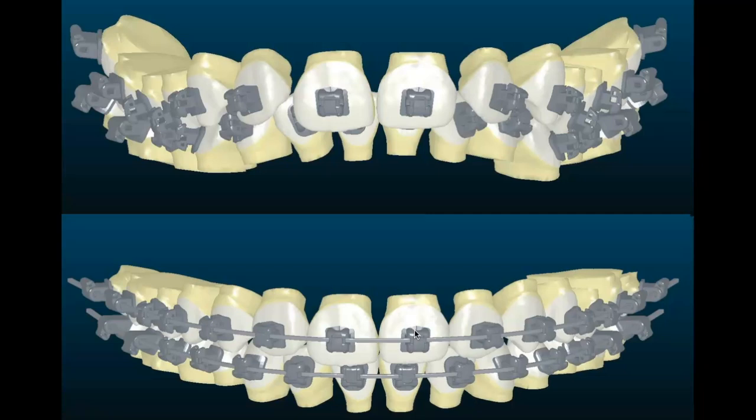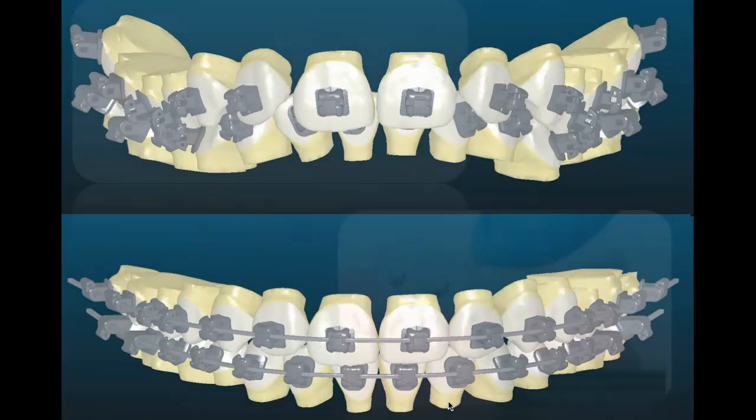And the reason was that we got our initial alignment, bite seating, all that was great. But there were a couple of big problems. So one is that these tubes in the back, you can kind of see how long they are. They created a long lever, basically, so they would break off all the time. And two, when you got to the fine details of rotation, because the slot was so big and there was nothing really holding it in the slot except for some elastics, rotations were really hard to work out.